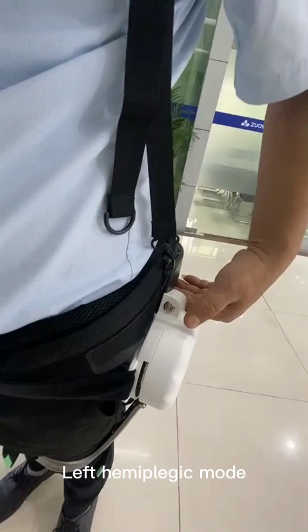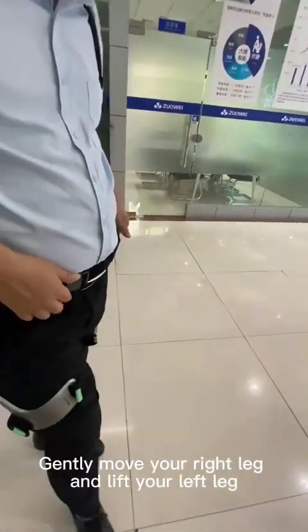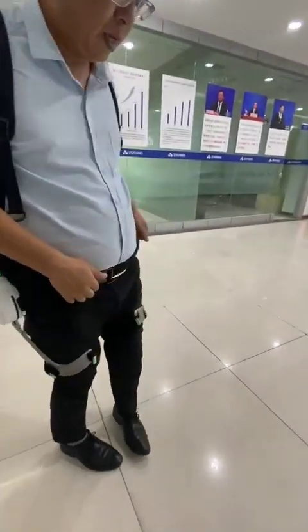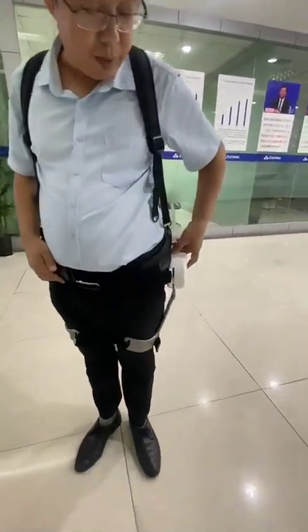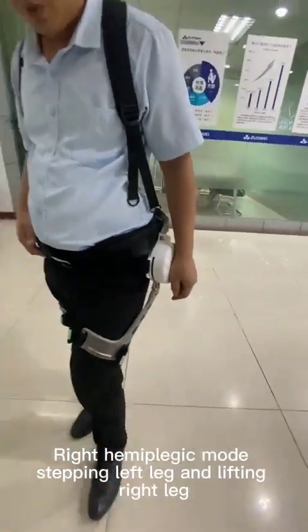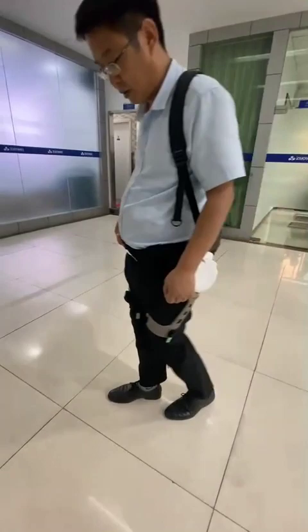In left hemiplegic mode, we move our right leg — gently move your right leg and lift your left leg. For right hemiplegia, press and hold this key again for 3 seconds to enter right hemiplegic mode: stepping left leg and lifting right leg.